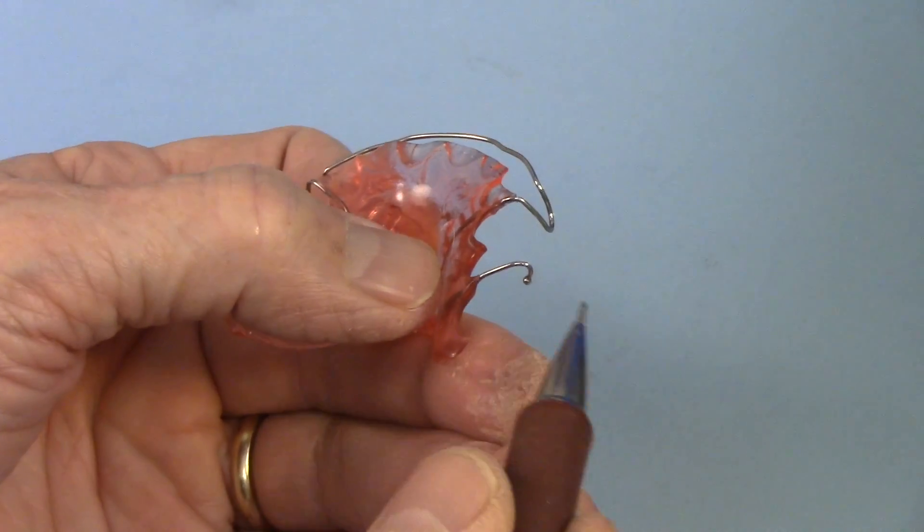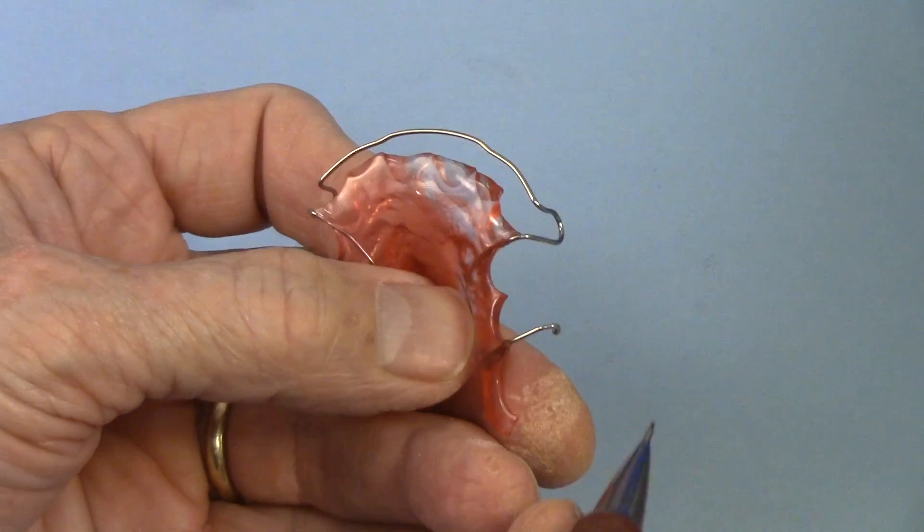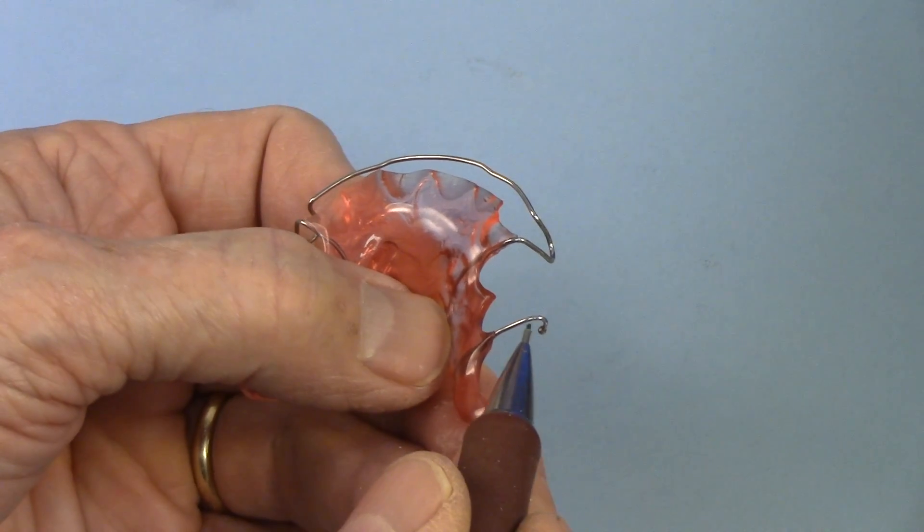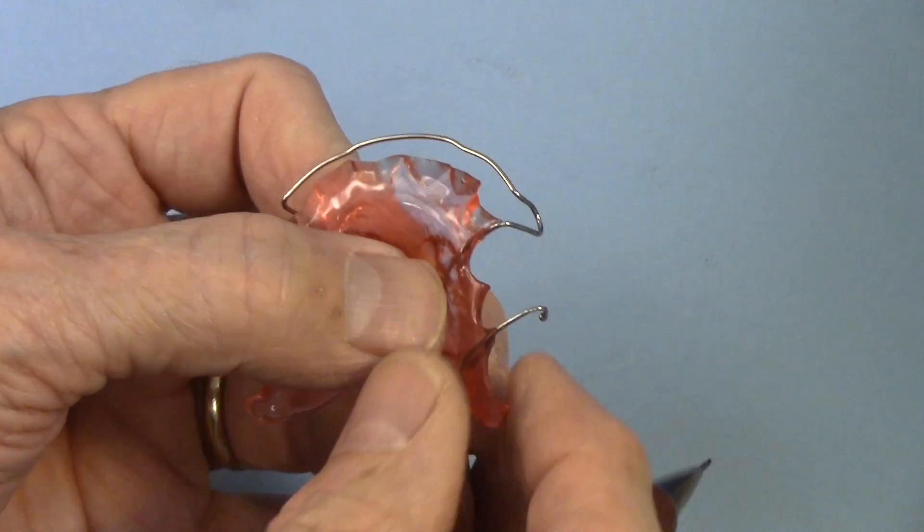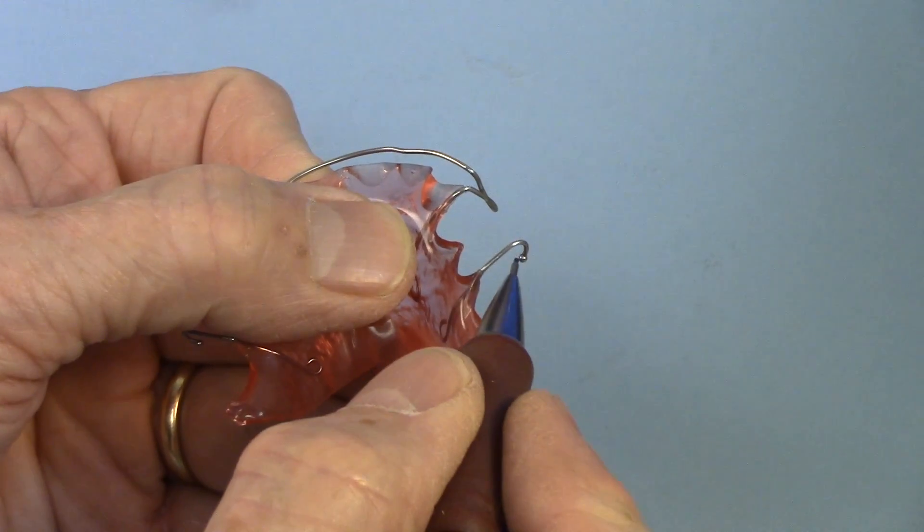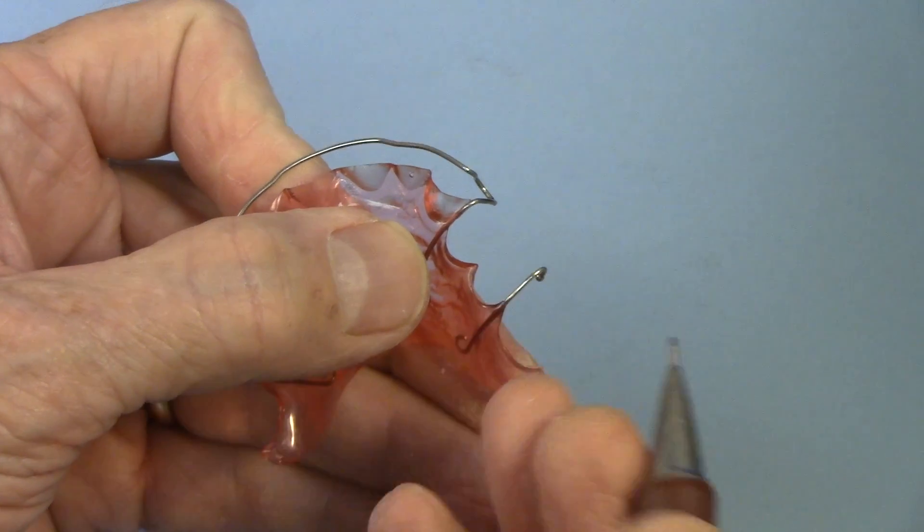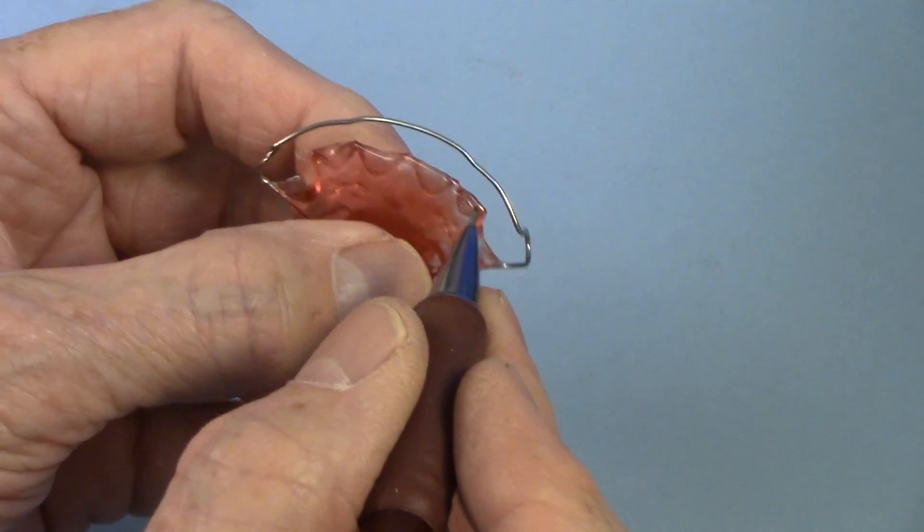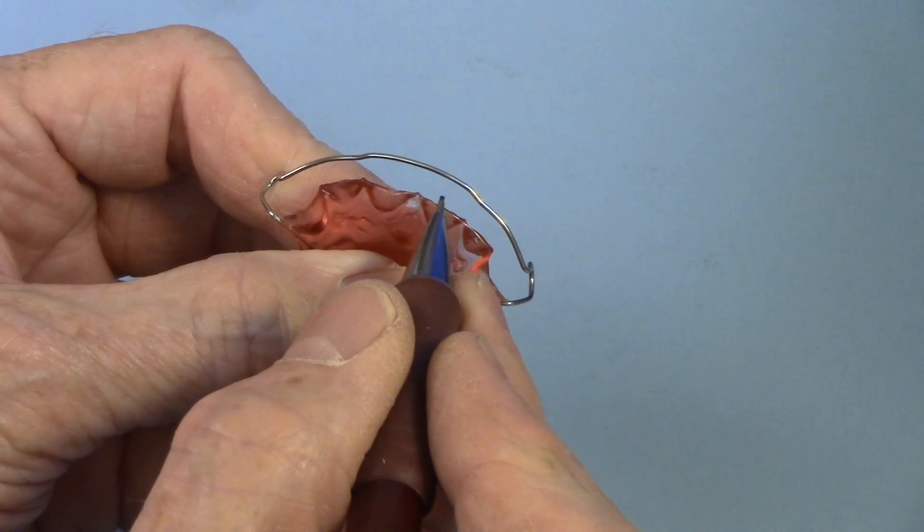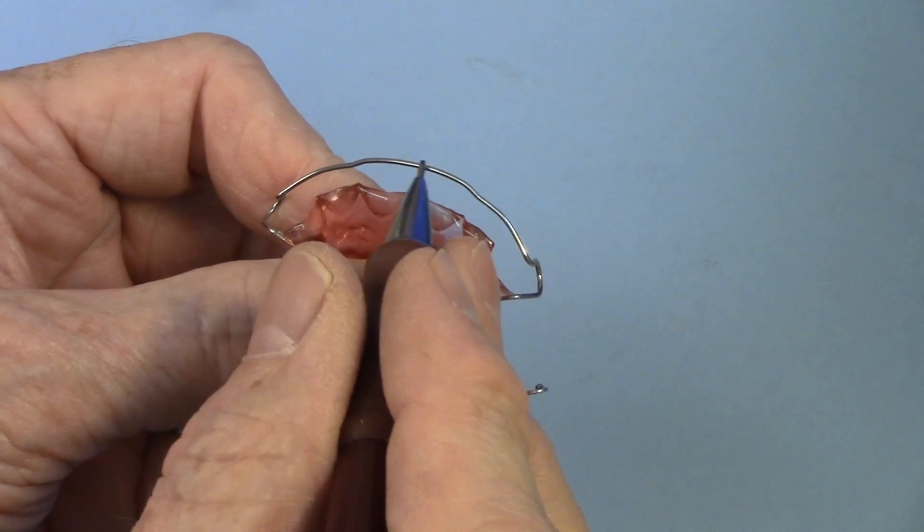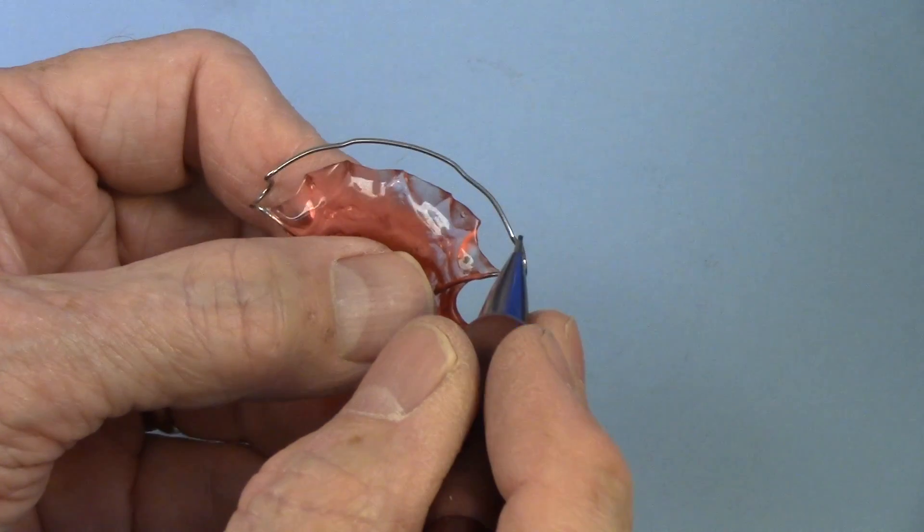Okay, so if you've got a retainer and it's got a ball clasp and a labial bow, you don't have any choice on the ball clasp. It comes as it is and it's probably about a three-quarter temper nickel-chromium wire. It's got a little ball attached to it. So you have to go with what you can get from the manufacturer. But on the labial bow, you have choices. Now, if you have a tooth out of alignment and you need this wire to be springy to move that tooth back, of course, you're going to need something with a more springy temper to it.